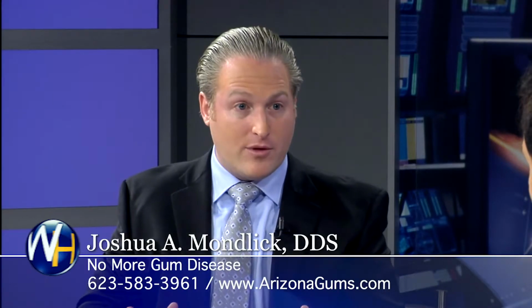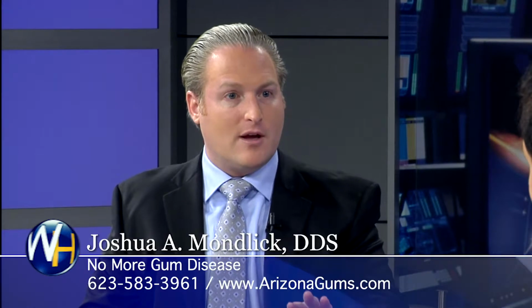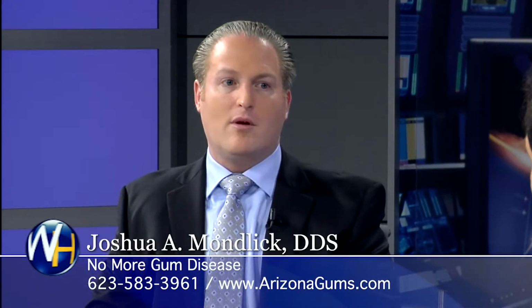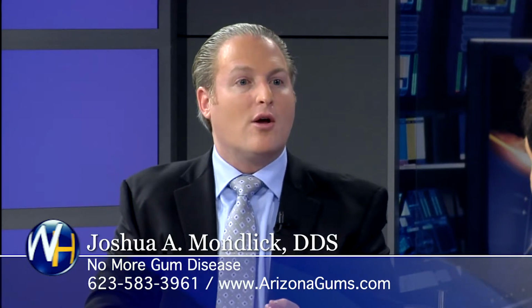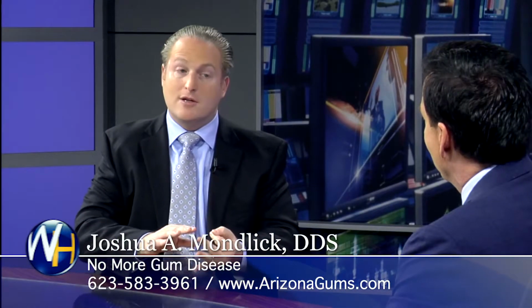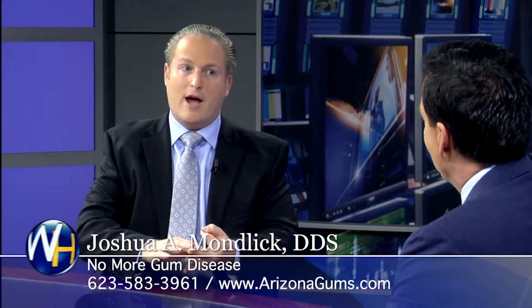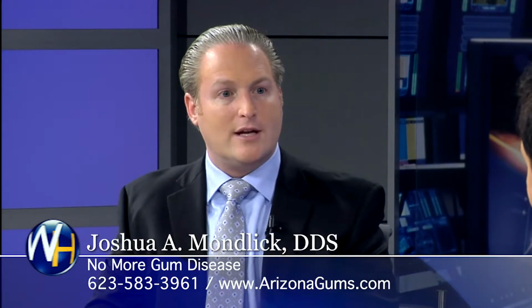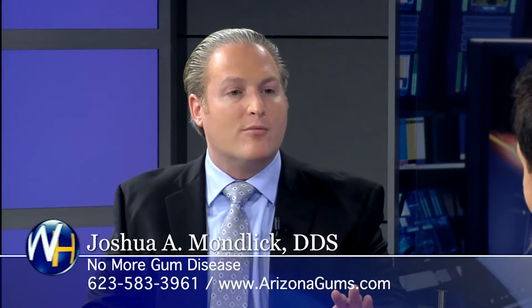And so I go around the mouth with a laser. We do the whole mouth, and even though it's only affecting a handful of teeth, we do the whole mouth. And 8 months later, incredible results. We're seeing greater bone surrounding those teeth. They firmed up. They're still a little bit mobile, but they're not going to be ones that are slated for removal anymore. And this guy's going to hold on to his teeth. He couldn't be more over the moon, Randy.